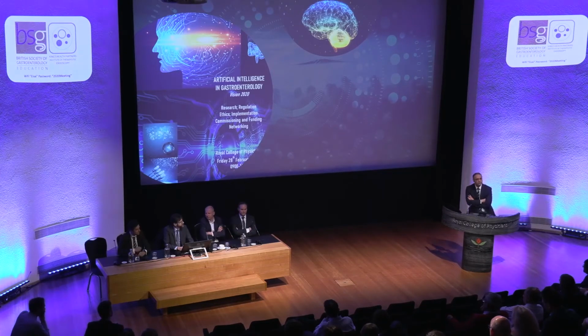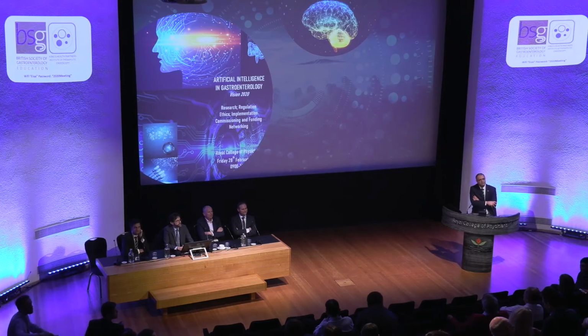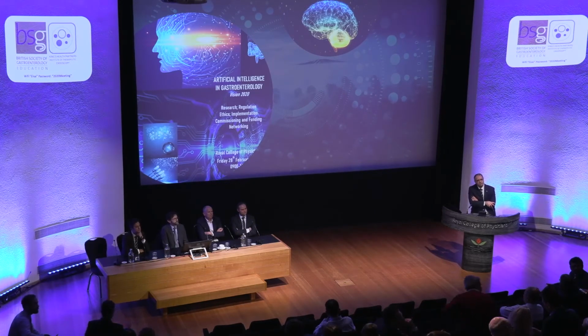Thank you. Audience: Hi, I'm from a Kentish District General Hospital, and my question really is, do any of these methods have a safety feature saying, hold on, you haven't investigated behind that fold, let's go back? There's a Chinese system which can do that in gastroscopy.